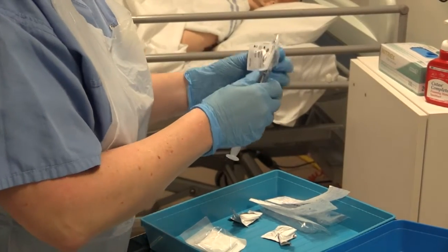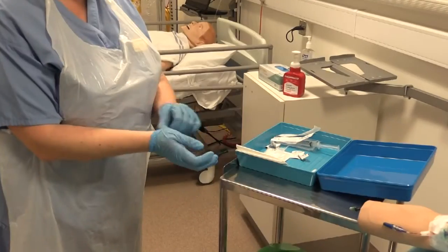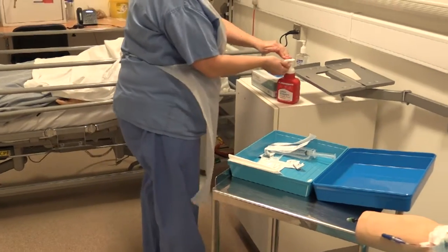You will also need one clinical laminate sheet for the procedure. You should now remove your gloves and discard, gel your hands, and put on new gloves.